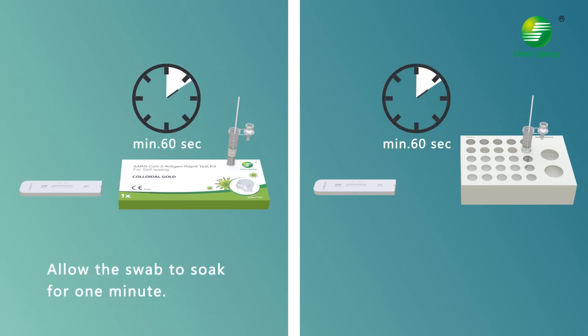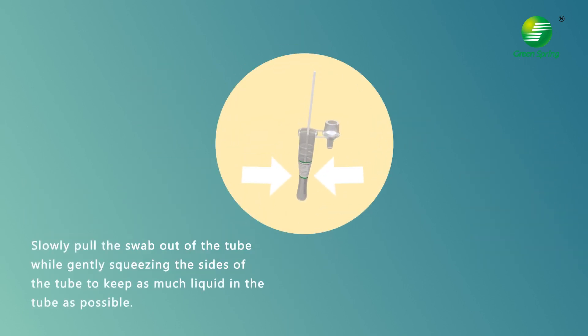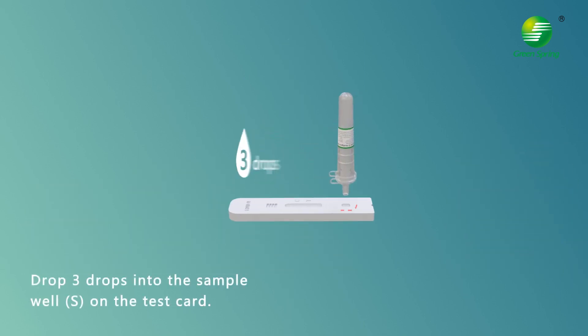Allow the swab to soak for one minute. Then slowly pull the swab out of the tube while gently squeezing the sides of the tube to keep as much liquid in the tube as possible. Place the dropper tip firmly on the extraction buffer tube and mix the liquid thoroughly, then drop three drops into the sample well on the test card.